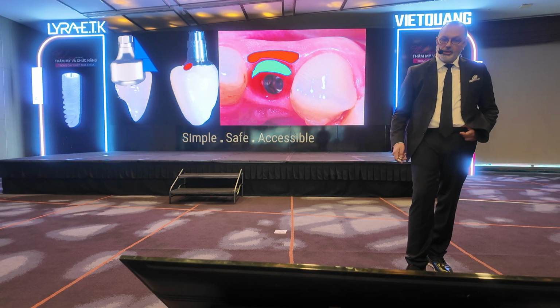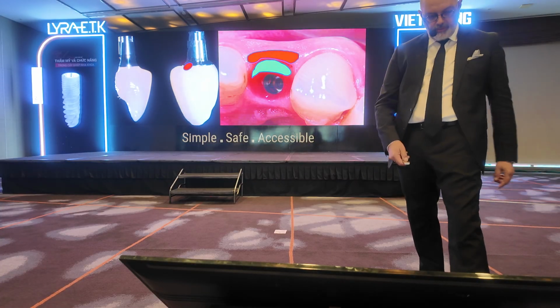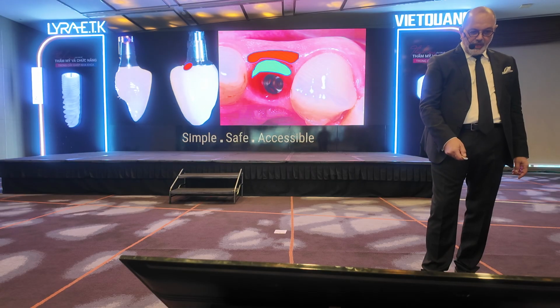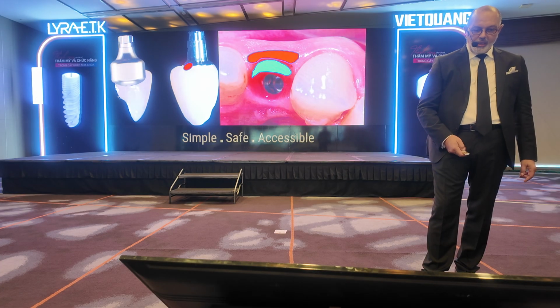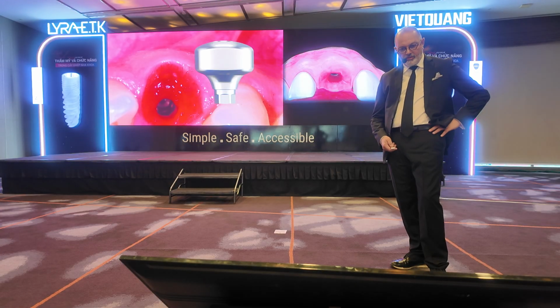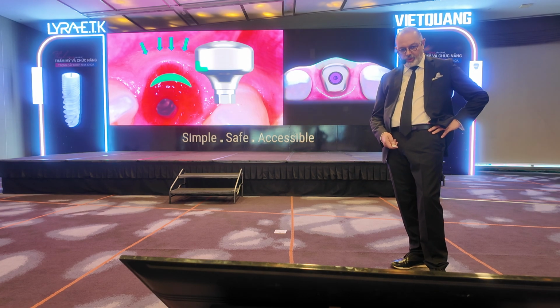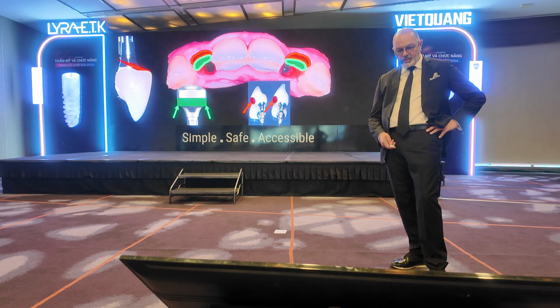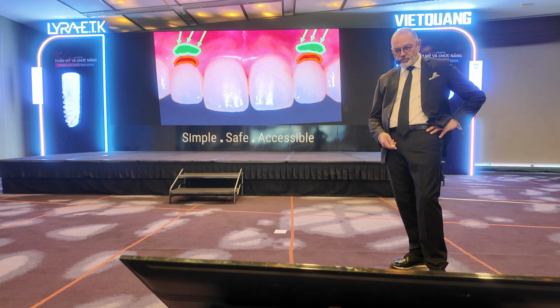And why? Because you divide this angulation here, which is very aggressive, by using a double S shape or a U shape, which is the shape of the epiphyseal. So this is the part, the green part, which will push immediately on the top of the crest. And this is what will give you stability in time, by dividing this angle in two parts.